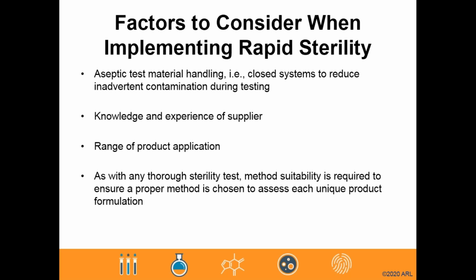Lastly, I would like to note that just like with any thorough sterility test, method suitability testing is required to ensure a proper method is chosen for each unique product formulation. Sampling requirements will vary based on methodology and laboratory's requirements. However, it is important to note that this will be a needed step prior to performing release rapid sterility testing.